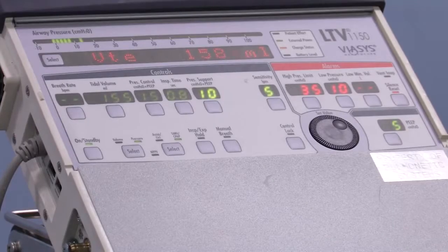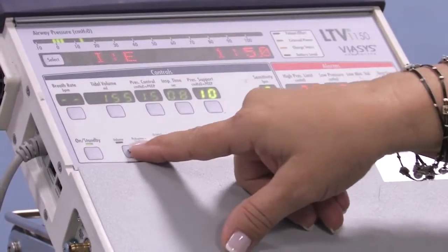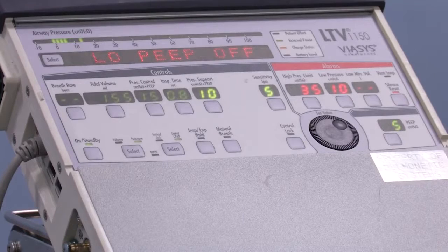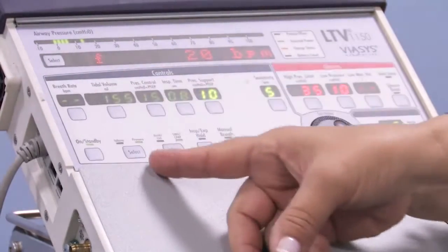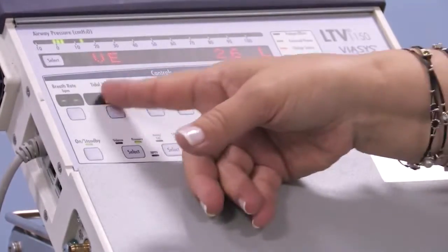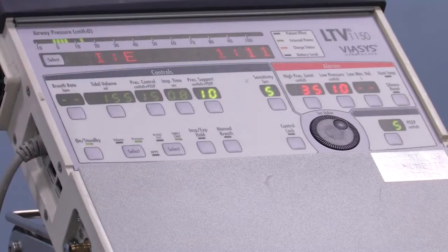One of these lights will be lit depending on which one down here is lit, and there'll be an inspiratory time. So it's going to actually fire a preset 12 breaths a minute. And you'll have to talk with your practitioners to see if 12 breaths a minute is enough, because there are other ways to finagle that. But what it'll do is fire 12 breaths a minute of the mandatory type of breaths that are set on the machine. So it is important to assure that these are in the right place for your child, because if it went into the apnea backup ventilation, you'd want to make sure the machine was going to fire a breath that was appropriate for your child's size.